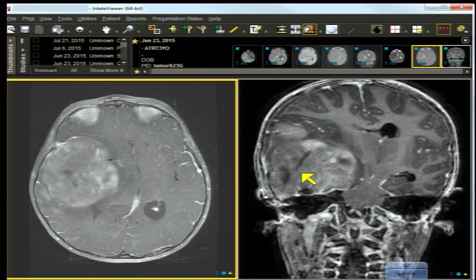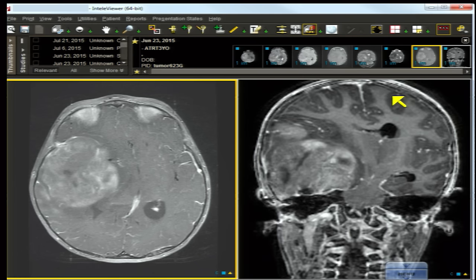Obstructive hydrocephalus is common. In this case, the entire ventricular system — especially the ventricles on the left — was dilated, meaning this mass is not only causing herniation on the right, but also obstructing the entire ventricular system. On MRI, lesions are solid with cystic foci. There is transependymal migration, periventricular infiltration, and leptomeningeal involvement.